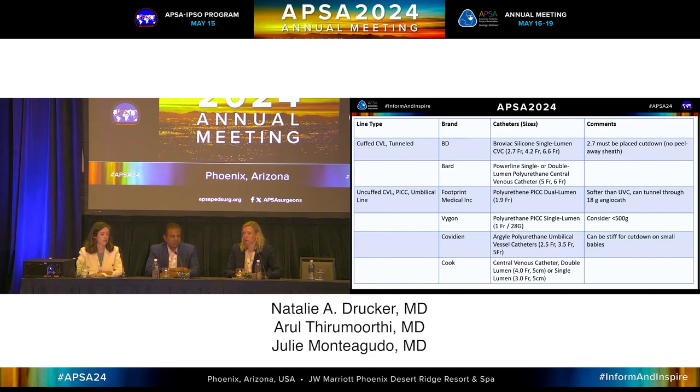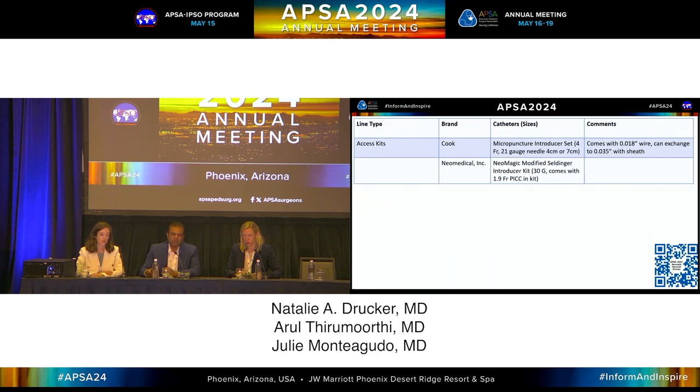That's why we wanted to make sure we talked about this, because you'll be asked to place them in neonates. We also compiled a list of all these different lines, all the things we talked about, for if you don't have them and are interested in doing more of these, whether it's the micropuncture needles, the IV lines that we're using, the PICC lines, and some of these others. This is all available on the drive, all the way through the access kits.